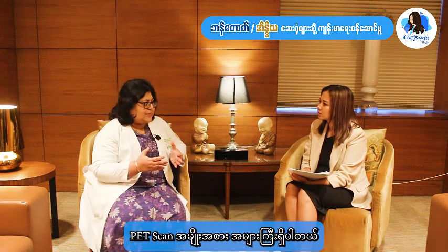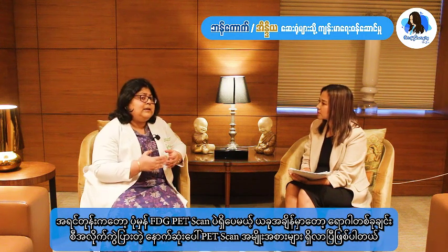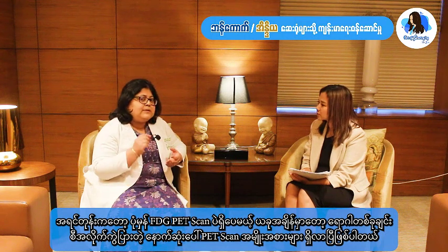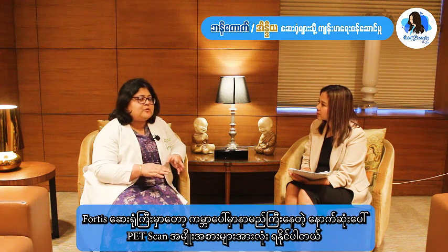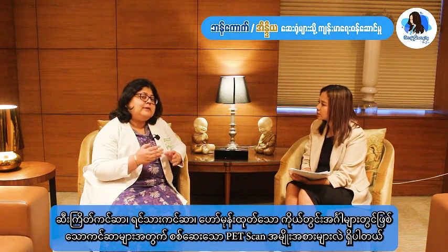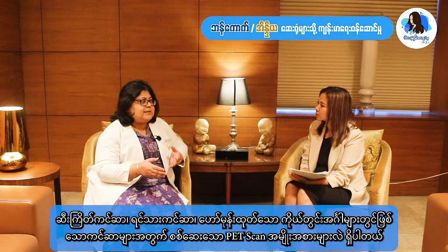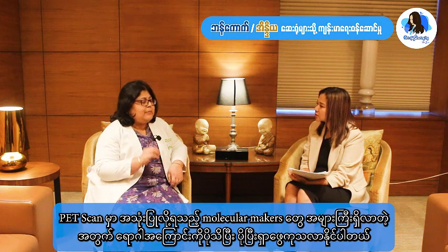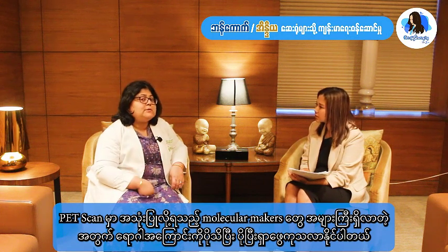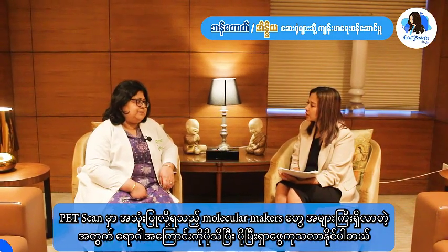And there are different kinds of PET scans. You have the regular FDG PET scans, but now there are many advanced forms of PET scans which are specific to a particular disease. At Fortis, we have access to practically all these kinds of PET scans available across the world. You have a different kind of PET scan for prostate cancer, for breast cancer, for a neuroendocrine tumor. Many of these molecular markers are used for doing these PET scans, which give us a lot of insight about the disease.